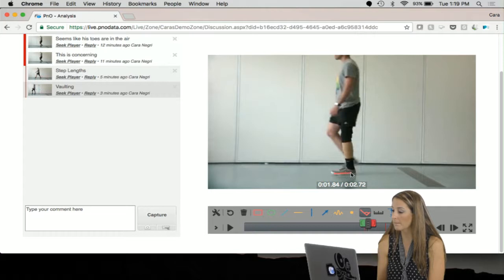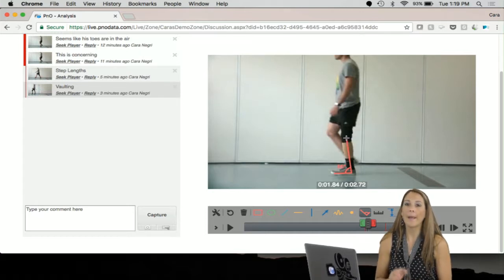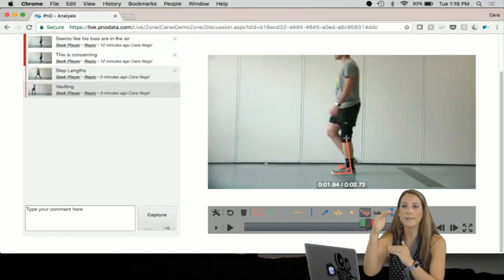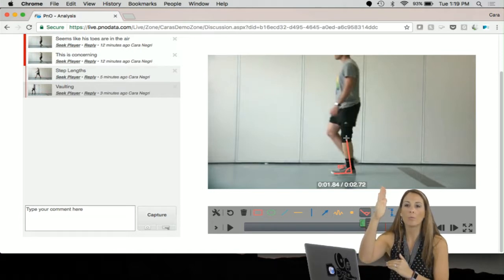It messed up. And then I will go up, and I will connect it all the way to the knee. So then that way I know that I actually connected it to the knee. I didn't stop short of it. I've got it all the way to the knee, meaning that I've got a more reliable measurement because I went all the way to the knee.